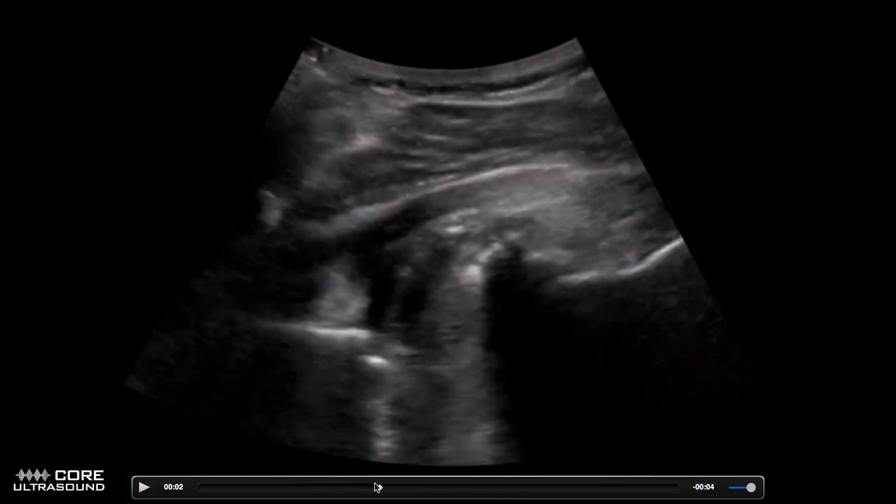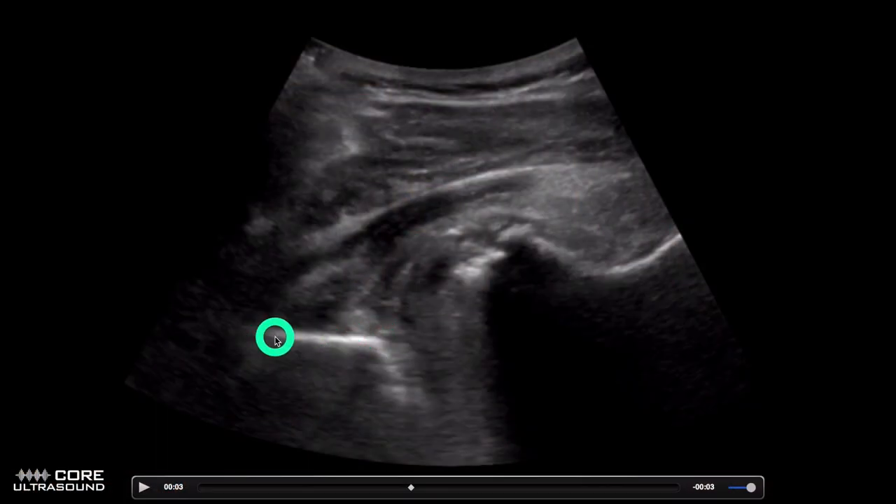So this right here is a posterior view of the elbow. After two years of critical care fellowship, I haven't done many elbow exams. When I looked at this, I was like, oh, we're looking at appendicitis — that's the psoas, pelvic rim. I'm so far removed now. But this is good. So this is the humerus right here, and this is the olecranon right here.